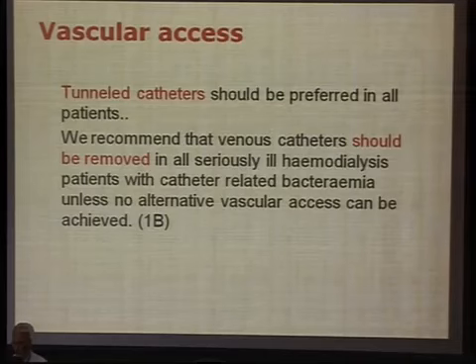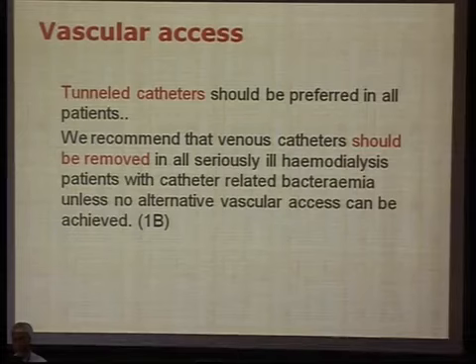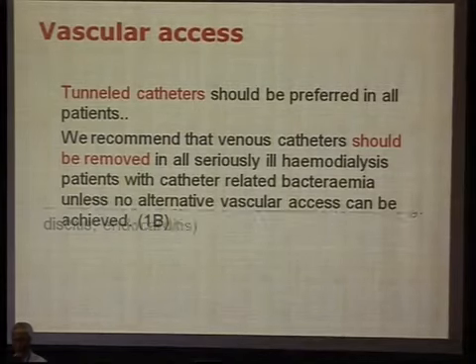Tunnel catheter should be preferred for all patients. If you are planning to do hemodialysis for more than 3 weeks, you must put your patient on a tunnel catheter, not on a temporary catheter, which is very important. The incidence of infection with a tunnel catheter is significantly lower than with a temporary catheter.